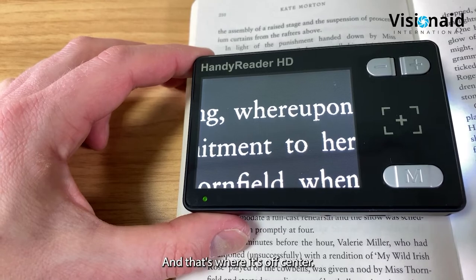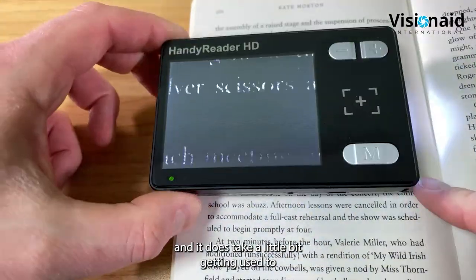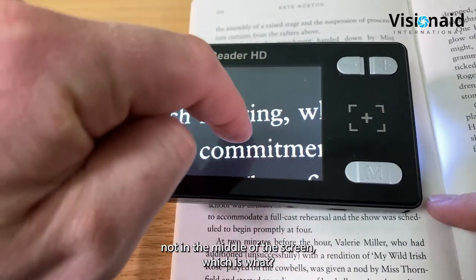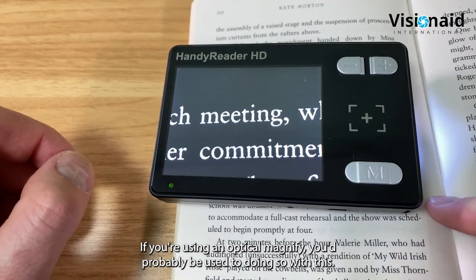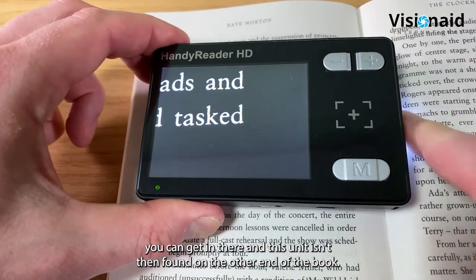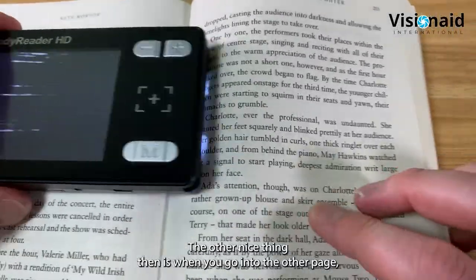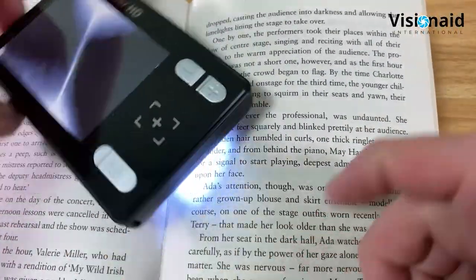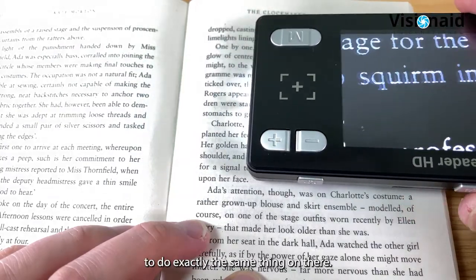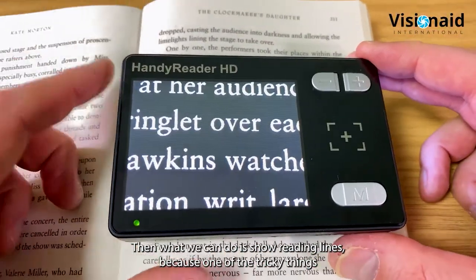You can also use the Handy Reader HD to read books, where its off-center camera design helps considerably. The camera is off to the right-hand side - you place it to the right of your target, not the middle. This lets you get right into the spine of a book without the unit fouling the other edge. For the opposite page, simply flip the unit 180 degrees and it flips the image around, allowing you to use it the other way up just as easily.